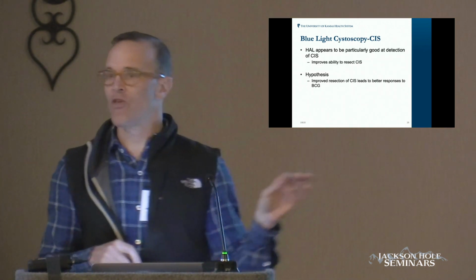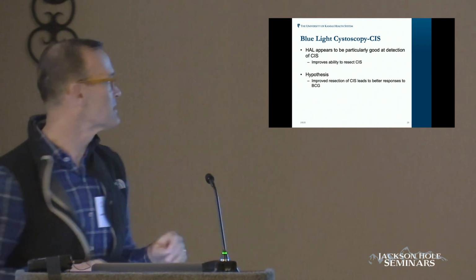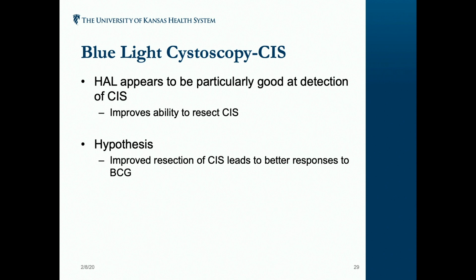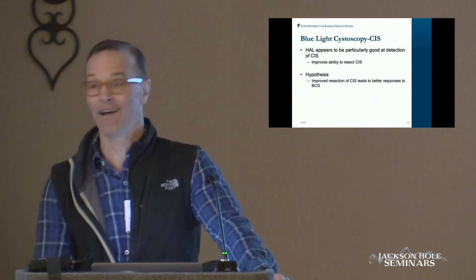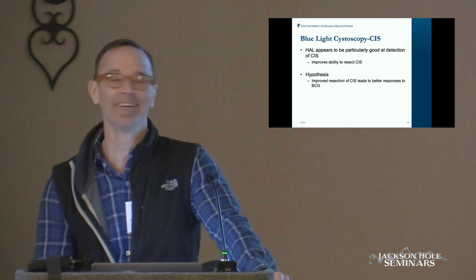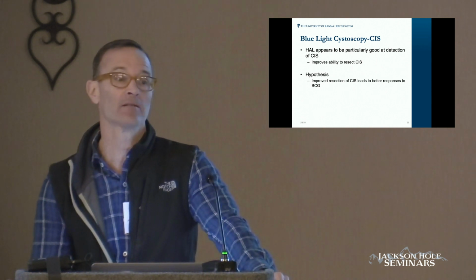So, as I mentioned, I think that blue light can be particularly useful at detecting carcinoma in situ. And why is that important? Okay, here's where I'm going to put a target on my back. I do not believe that you can leave CIS and treat it with BCG and it works. I don't believe that. I think you need to take it out or you need to get rid of it. Now, that is, Trinity's smiling, that is not what EAU guidelines suggest. The people think that that's not true.